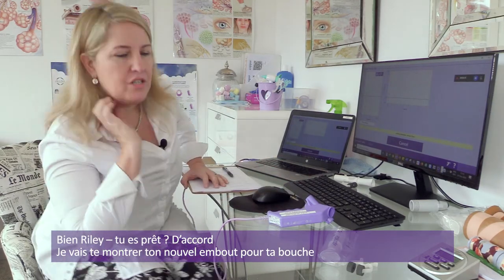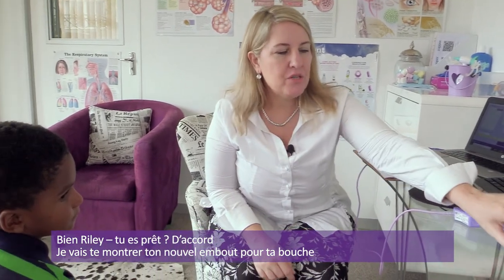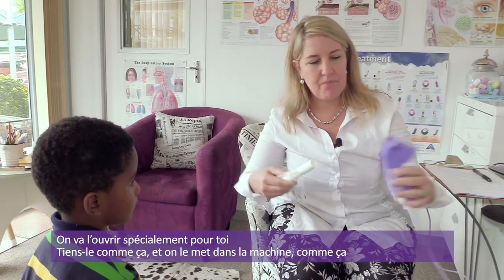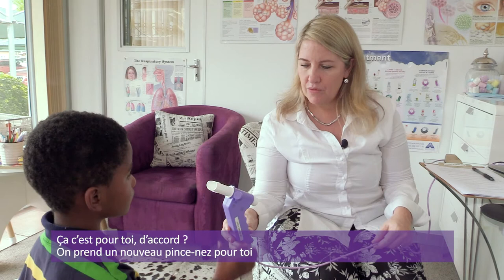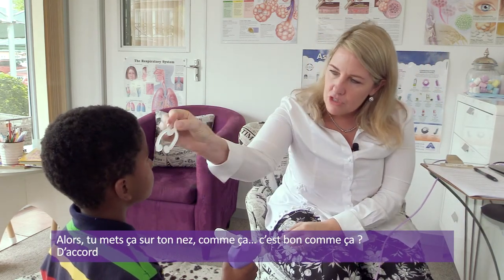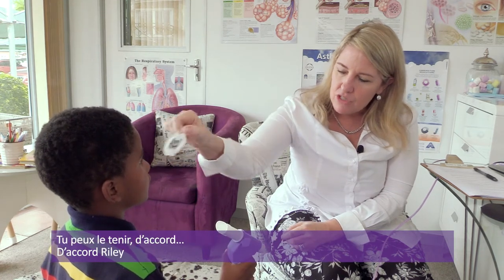All right. Good. Okay, Riley. So, are you ready to get started? All right. So, what I'm going to do is just show you your new mouthpiece. We're going to open it especially for you. Hold it like that. Put it into the machine like that. Okay? So that's for you. All right? Let's get you a new nose clip. Okay? So this is a clip that's going to just go onto your nose like that. How does that feel? Okay? All right. So you can hold this.